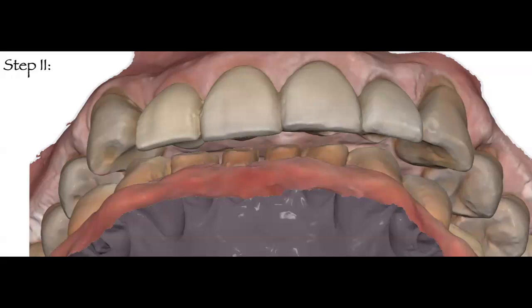And when I place my leaf gauge, I'm always going to ask my patient, and I'll start with one or two leaf gauges, to move their jaw forward all the way up to an edge-to-edge position, and then to go right back into the mandible, trying to make all their posterior teeth come into contact. Now, of course, because they have the leaf gauge in between the maxillary and mandibular incisors, posterior teeth should not and will not contact.